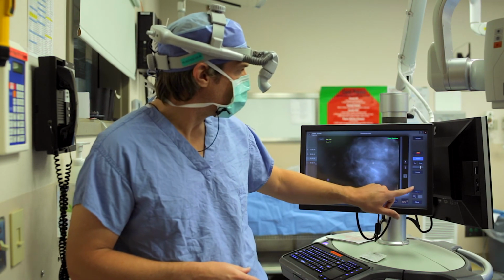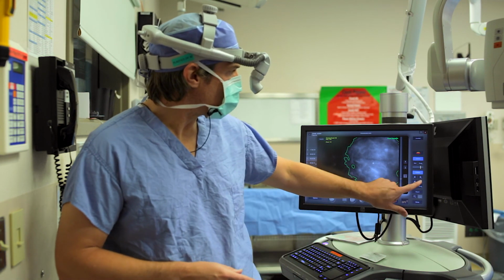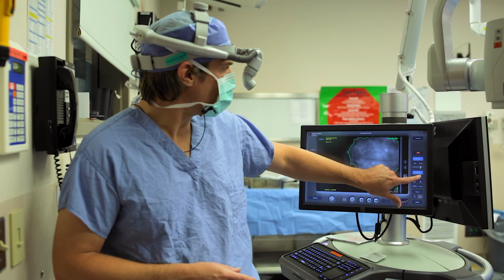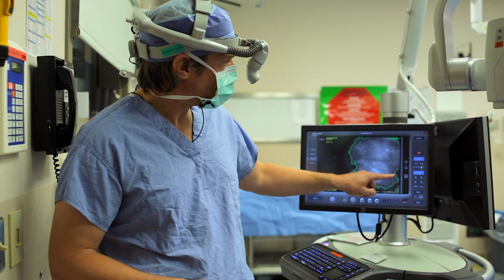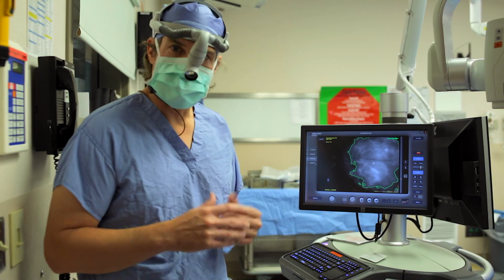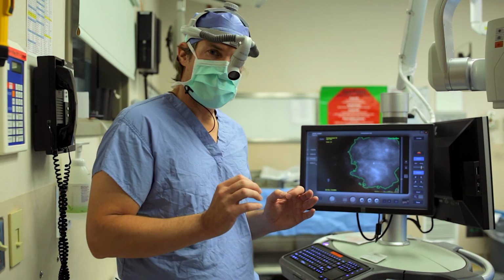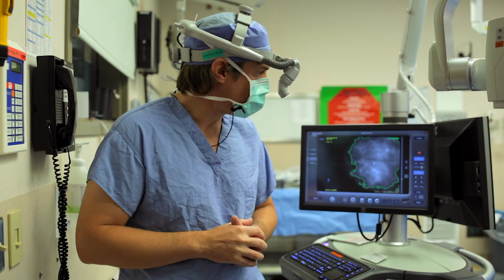We can also, again, use some of the software that this machine has, and I can set the contour to help me outline some of the areas that are perfused poorly. And so now this has drawn a green line, and outside of the green line are areas below the level of contour 15. Now that 15, as we talked about previously, is an absolute number. How absolutely bright are we seeing that dye?